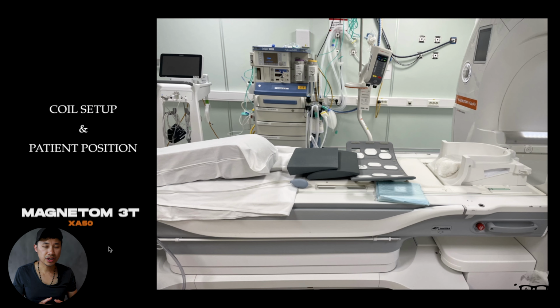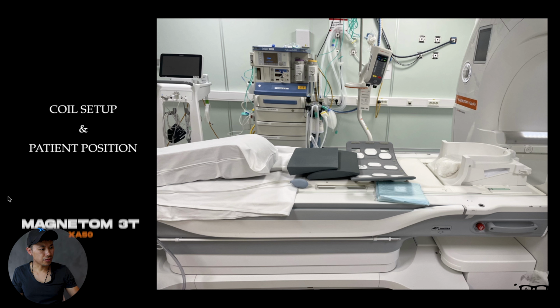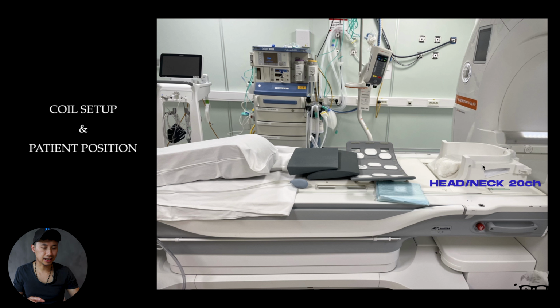All right, like I mentioned, we are at 3T, and I will show you what I did. If you look at this image right here, it's the coil setup. So this is a 3T, the patient position. I'm going to show you everything. So I'm using a head neck 20 just to position the patient. And behind that, it's our Ultraflex 18 channel. That's the main point, the Ultraflex 18 channel. If you have it available, please try it out and let me know.